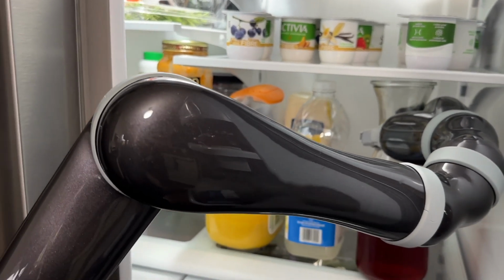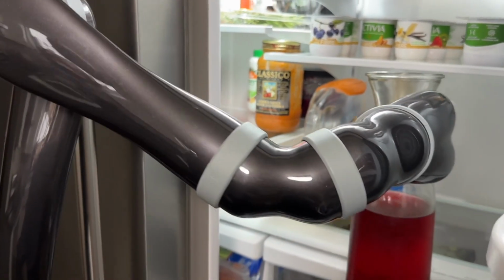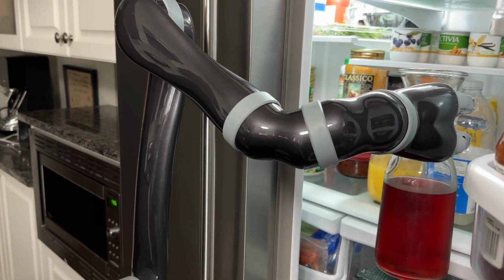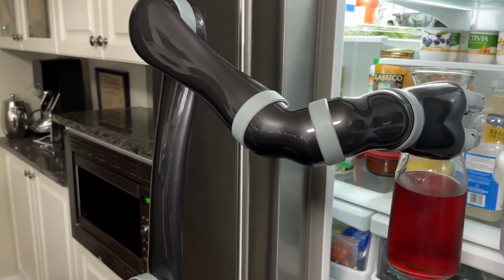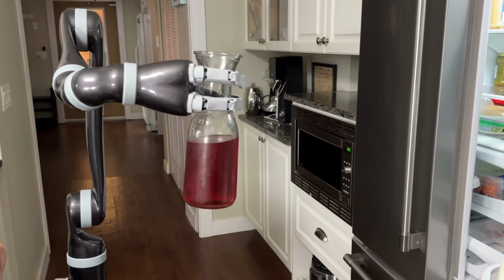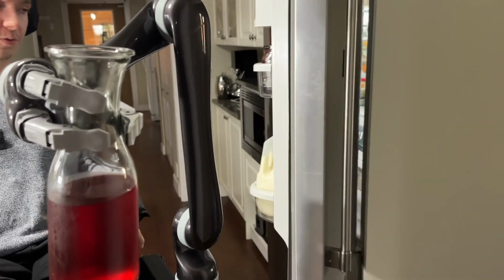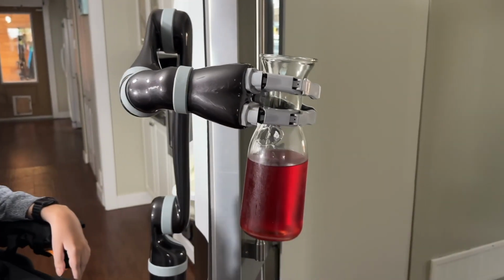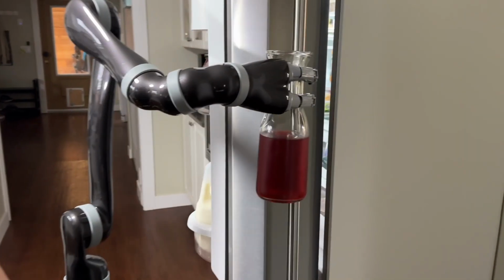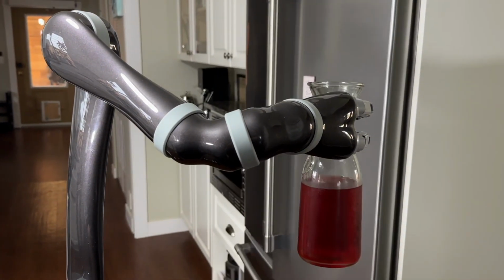Here we go. Bringing it towards us. All right, so we've got this, and again, instead of moving Jaco, I'm just going to move myself in my chair. A quick thing that you can do to save some time is use your hand that's already out to close your refrigerator. So I'm going to get in behind here and just give the fridge door a little tap with Jaco's hand, and there it goes. Closed.